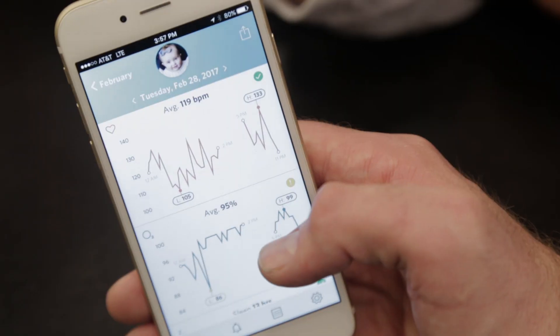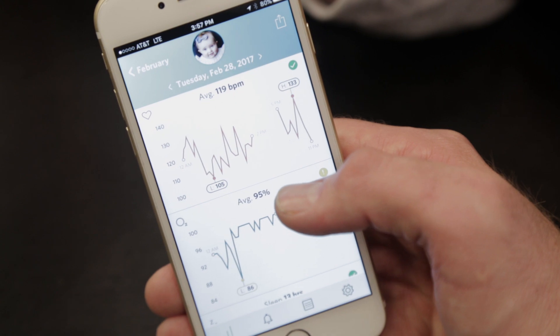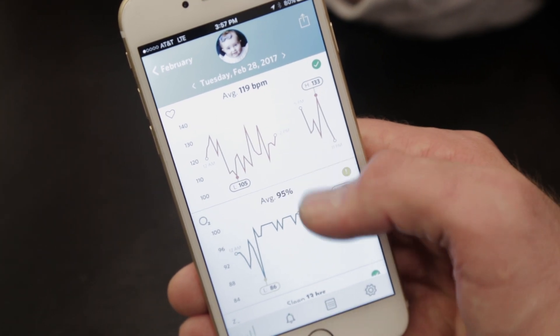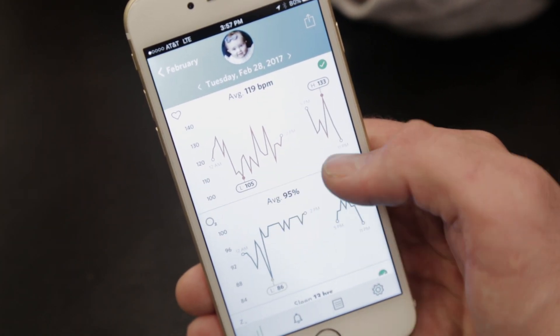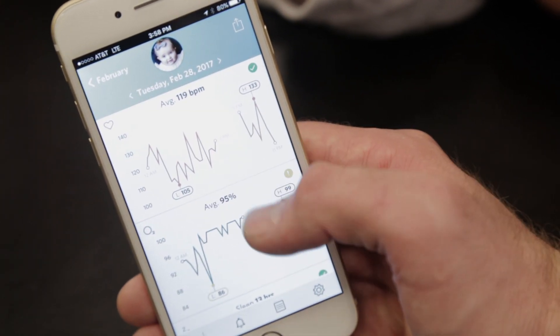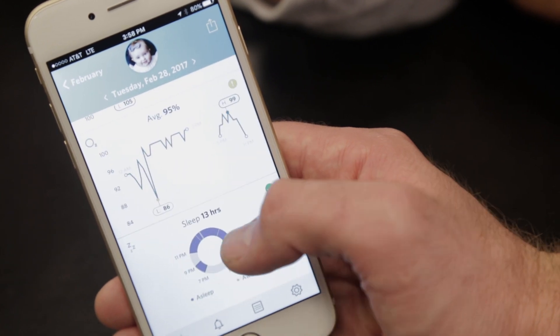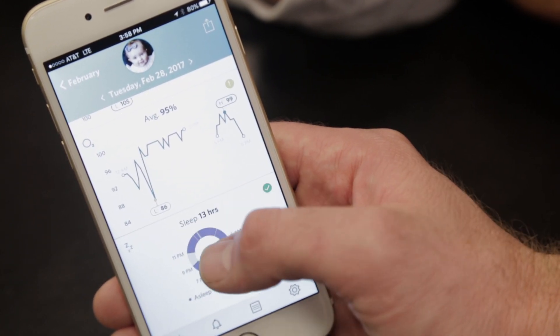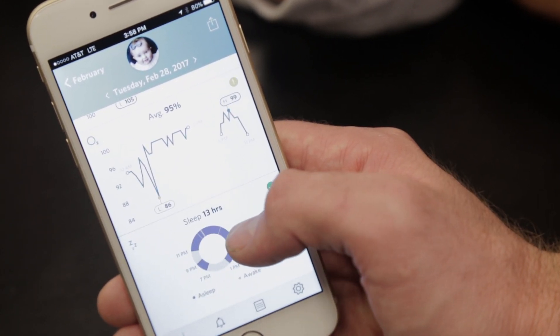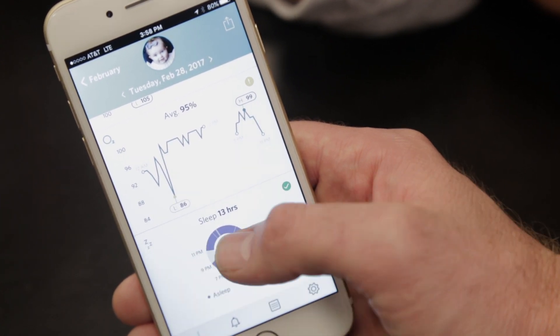We've also created a new app feature called Connected Care. Inside of Connected Care, you can actually track your baby's heart rate and oxygen levels over time, trend those, and look at percentile comparisons with other babies. We also have a new feature that tracks your baby's sleep, so you can go deeper into analytics and look at what her normal nap routine is and how she sleeps better under certain conditions versus others.